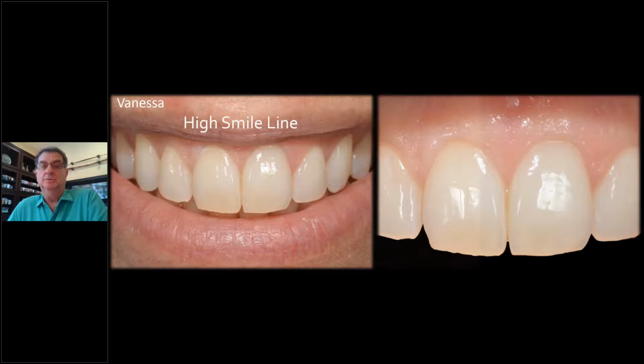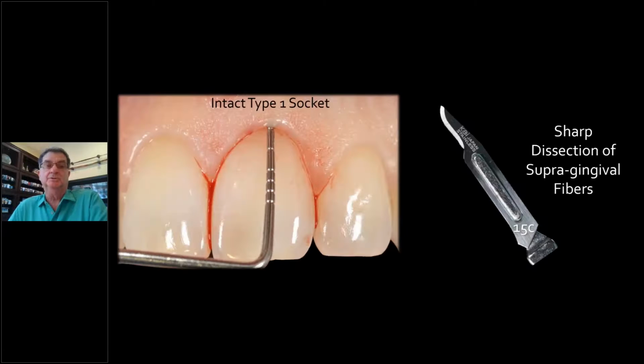Now, the first thing we do, scalpel incision. Let me take it through. As you see, you can see the probe through. And you take small incisions. In other words, use small incision blades, 15C blades, any surgical blade that's small, so that you don't cut through the buccal tissue when you go around the turn. Advanced surgeons could use a regular 15, but I prefer a 15C. Makes it easier. Take it out cleanly, rotate and out.